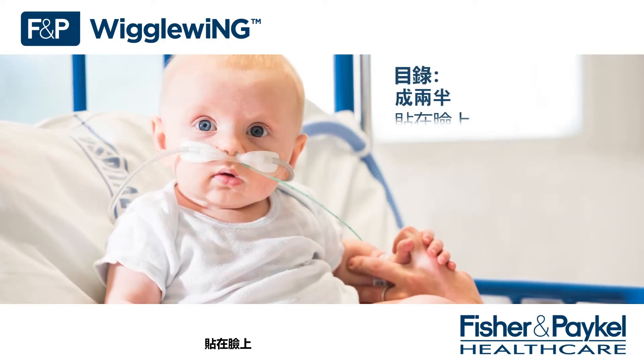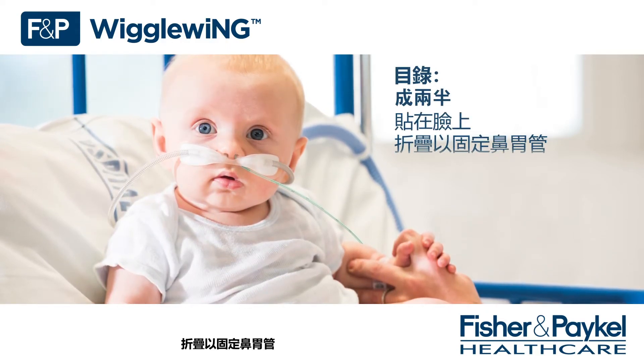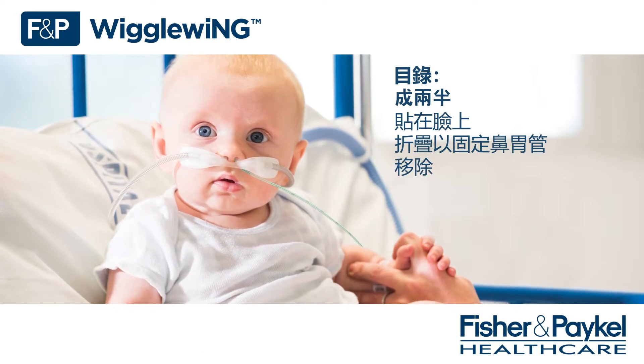The four parts are: rip in two, stick to face, fold to secure the NG tube, and removal.